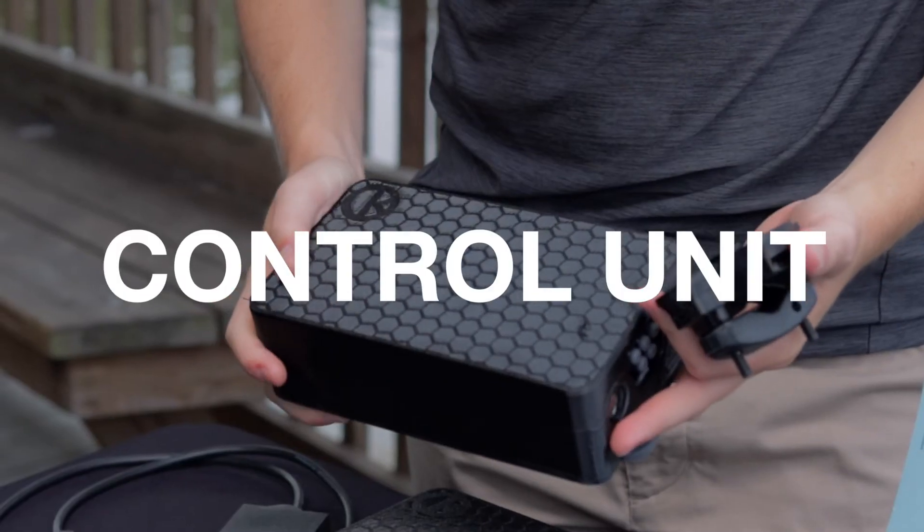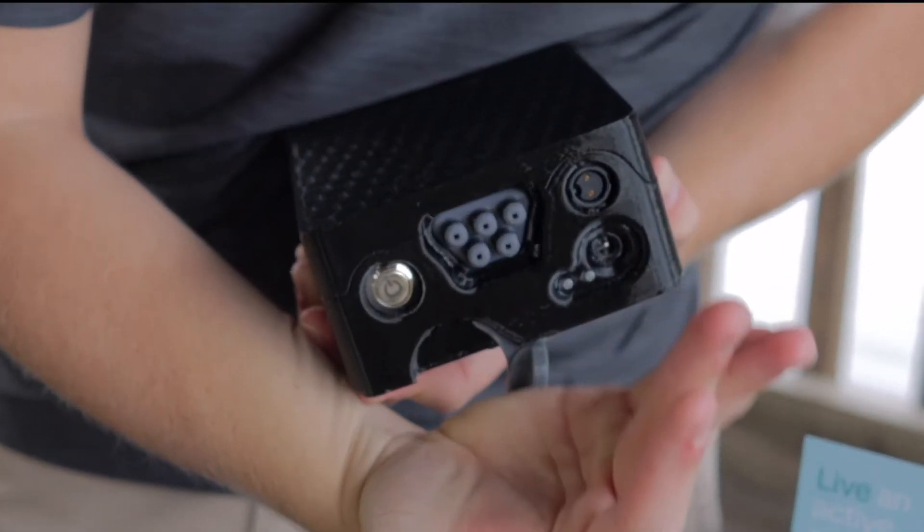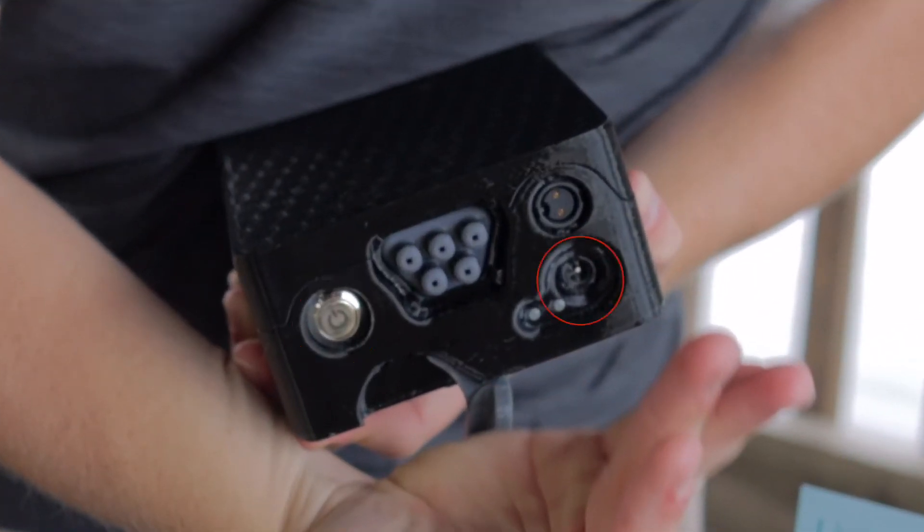The control unit powers the cushion. The control unit also includes the power button, the charging port, the status indicator, and the hose connector.